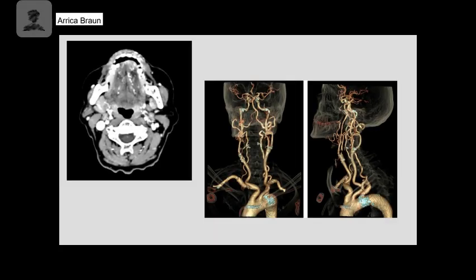On the left is an example of just the typical imaging that we utilize with the axials in CTAs. So we are able to see it in an axial slice. This patient has contrast introduced because I'm able to see the carotid arteries and identify that they've already split. So one's going to go up into the brain, and then one's going to go up and feed the face with contrast. So we'll be able to follow that all the way up through every slice and see then as it goes into the brain.